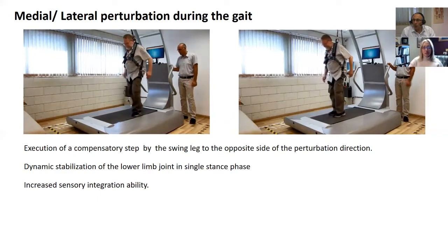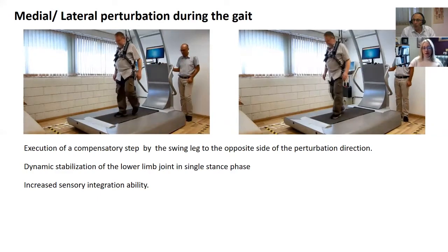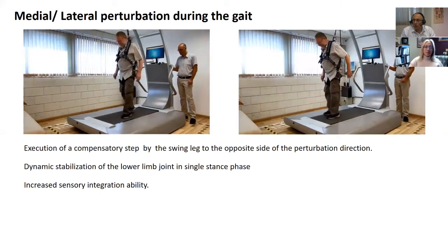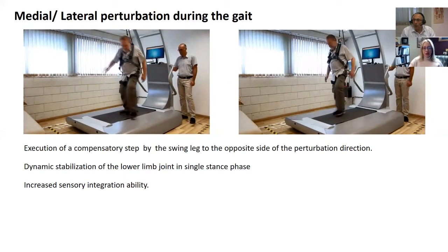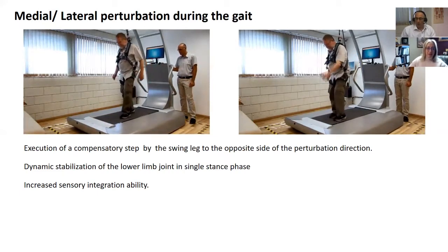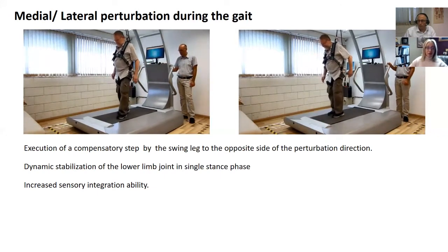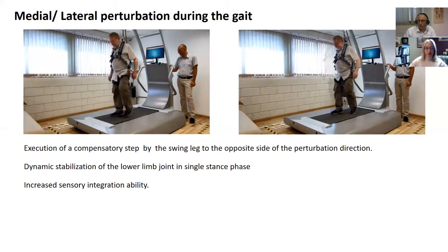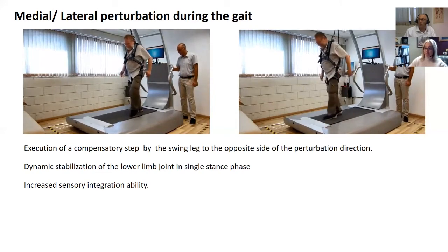And I enjoy that threshold of that perturbation, because you can see him try to weight bear more on that right leg. He takes a little step and then he'll take a bigger step as he has to reach with that left leg over to maintain his balance. So it's not only strengthening that right leg, but it's training the brain that he can stay up and not fall. He's figuring out his own type of, I guess you would say, compensatory strategy to stay up.